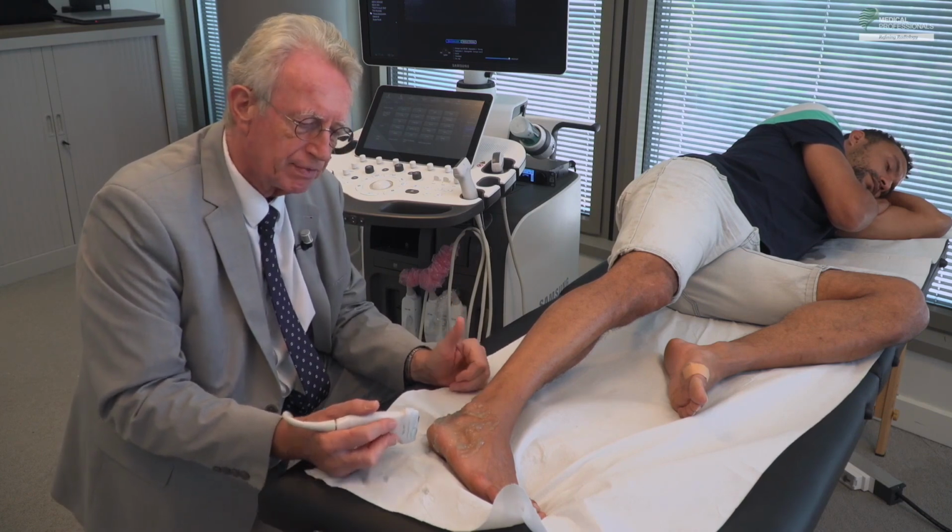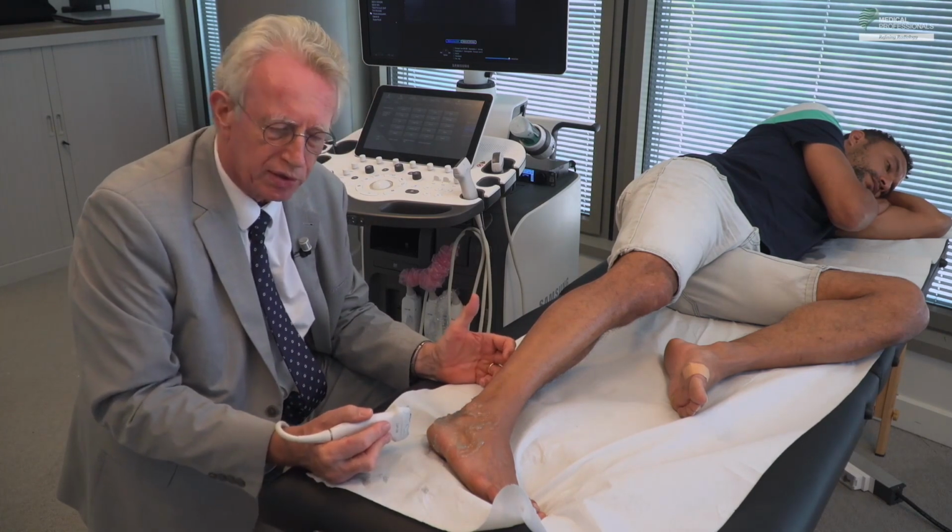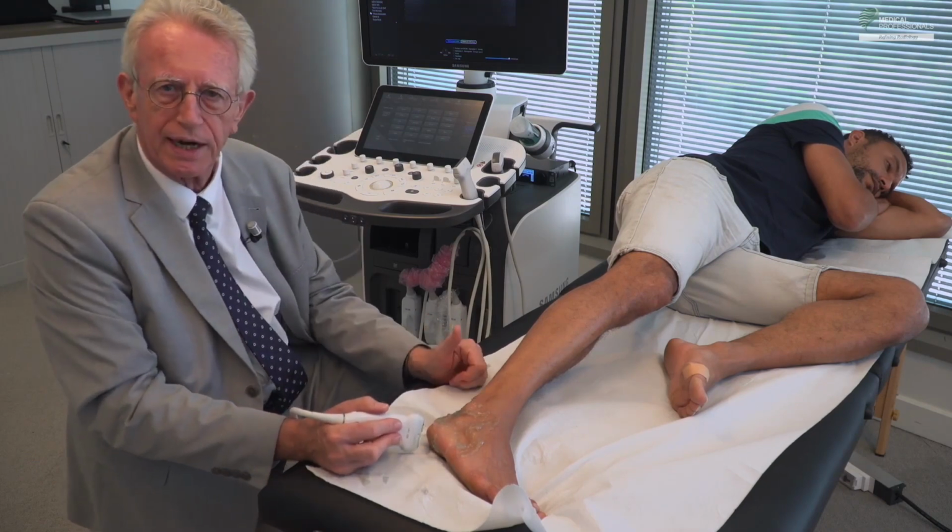So retinacular pathology, tendon pathology, and ligament pathology. This is what we will find on the lateral aspect of the ankle.